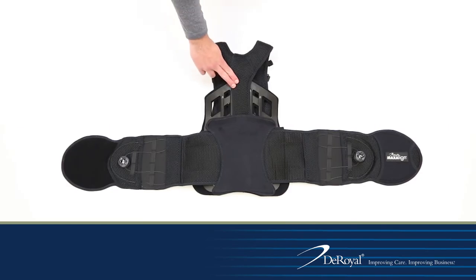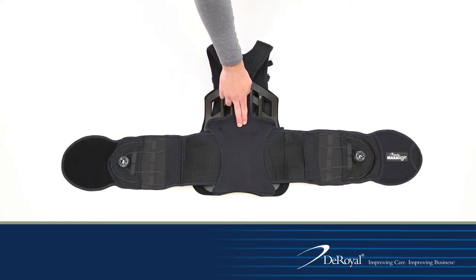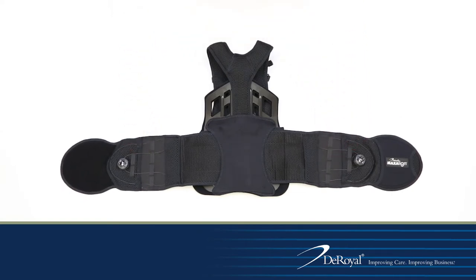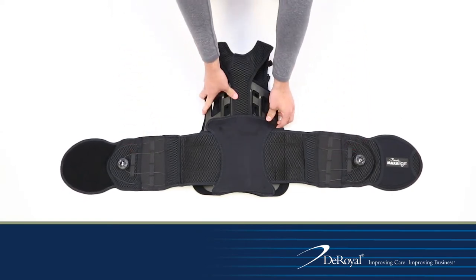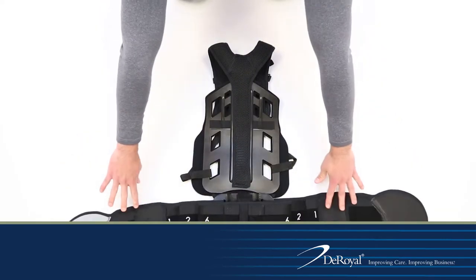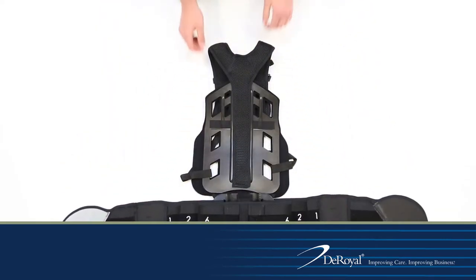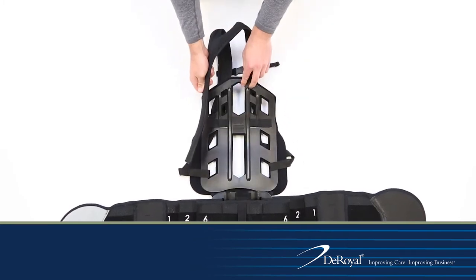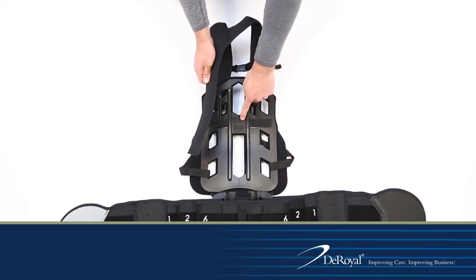The brace will come with the DLE already set up. To adjust the DLE height, place the brace face down with the Deroyle embossed privacy panel facing up. Ensure the belt arms are spread out completely and non-impinged. Unfasten the back panel hook closures and flip over the back panel and belt arms. Remove the DLE from the posterior panel and adjust higher or lower as necessary to fit the patient.